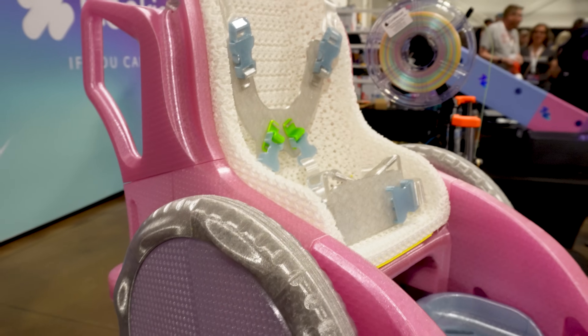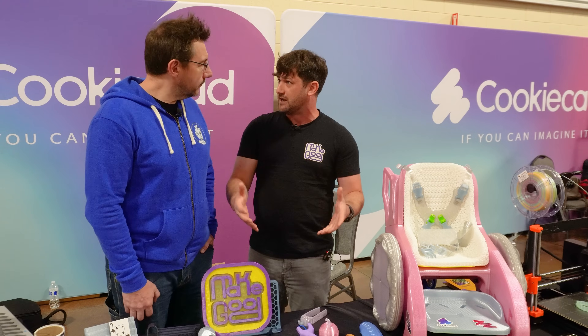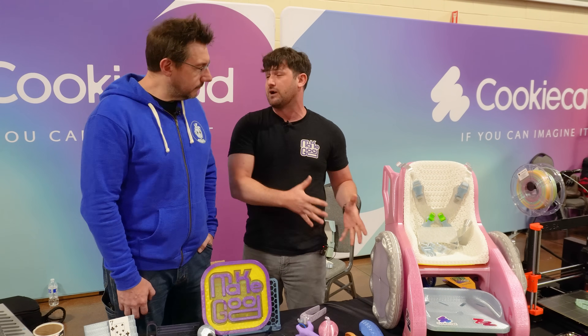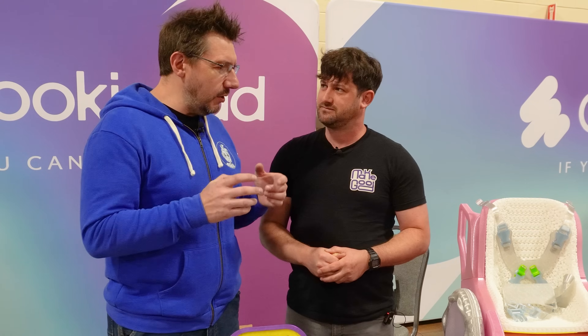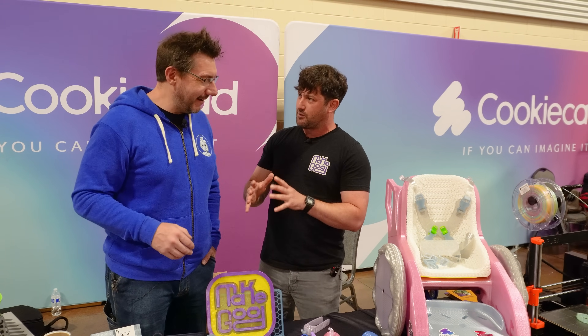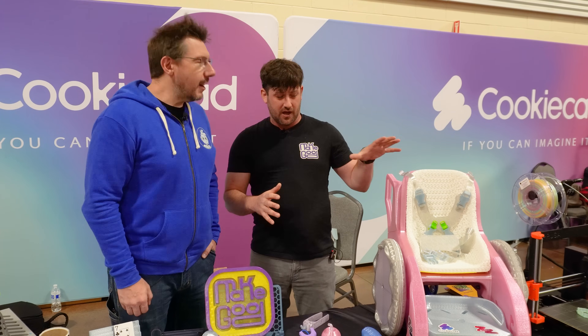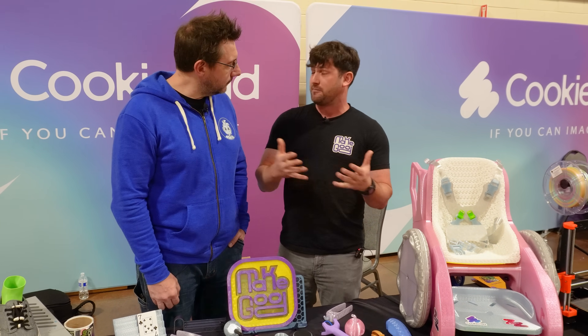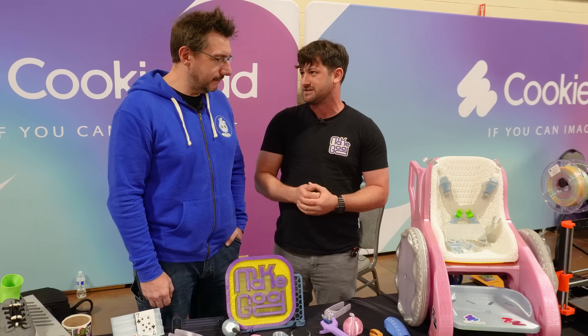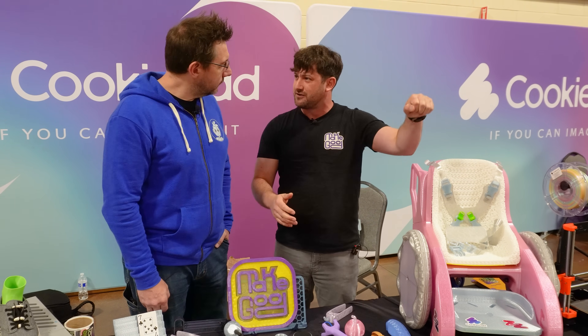People all over the world have reached out, ready to make these for their communities, for themselves, for other people. It just makes it a much easier process to deliver this really great device that helps a lot of kids around the world. So the STLs — not quite yet, but by early summer, the next couple of months. This is V2, V3 is already out in testing. We're going to have a public release with all the build files made completely free for anybody to download. And it being open source — somebody wants to make it motorized, the next version has accessory rails for parent push handles, tray tables, all sorts of stuff. Once you release this to the community, it's going to be modified in ways you never even thought possible.